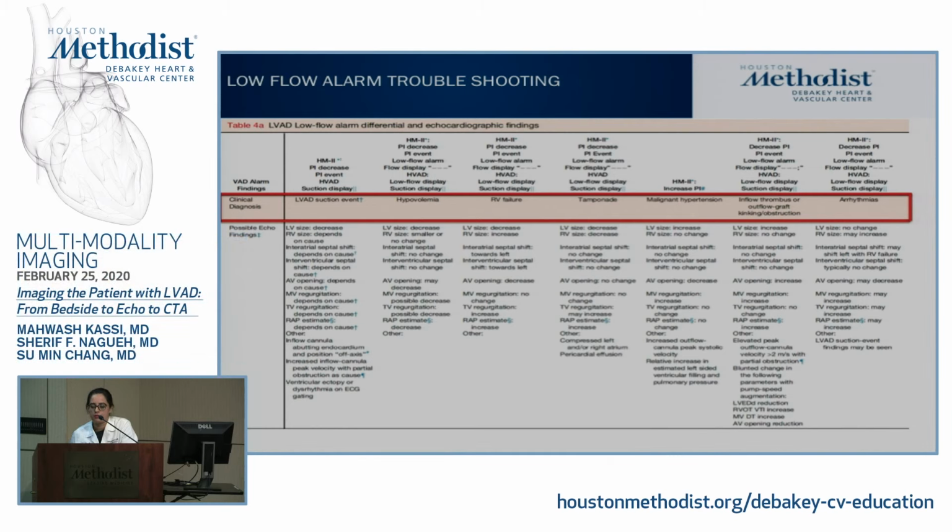And interestingly enough, for LVAD patients, it doesn't take a lot of volume to cause significant tamponade physiology. So it's not the same tamponade physiology that you see with other patients. You'll just see a compressed RV or a compressed ventricle that would basically lead to ineffective unloading.